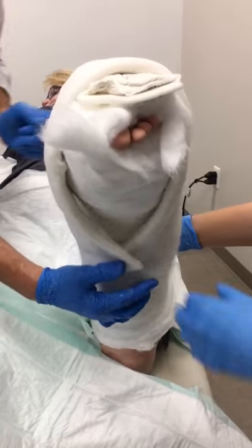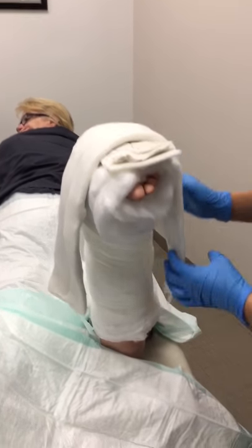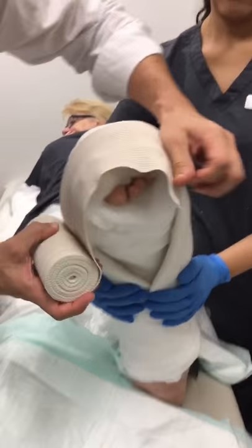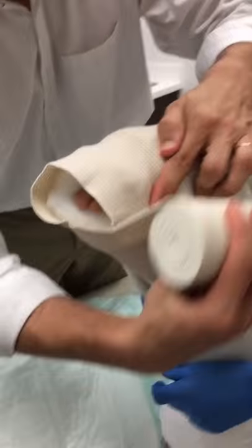Next, the 6 inch double ace wrap. I overlap again here and we can do a little bit of compression through this as well.